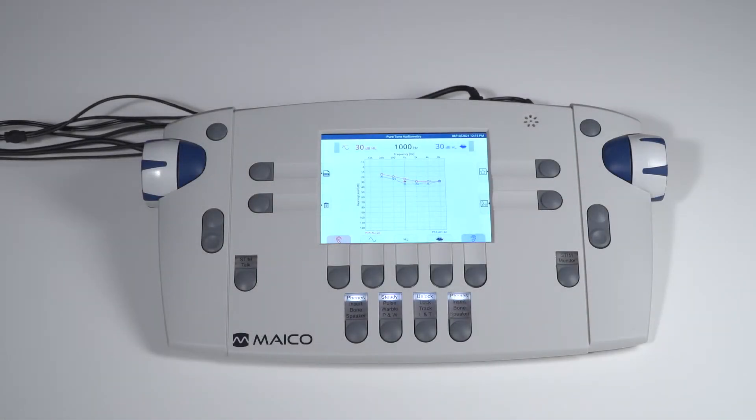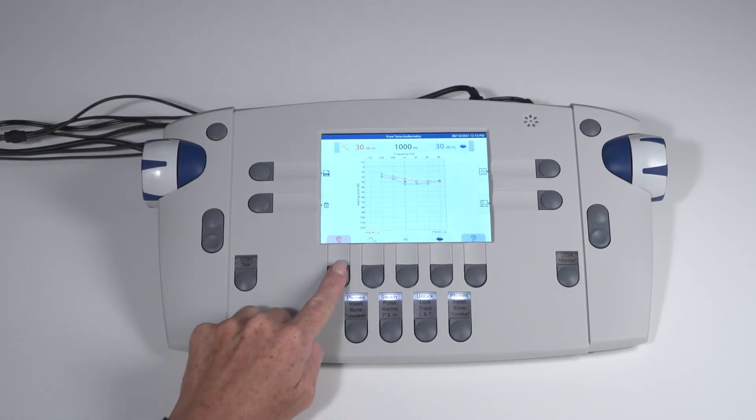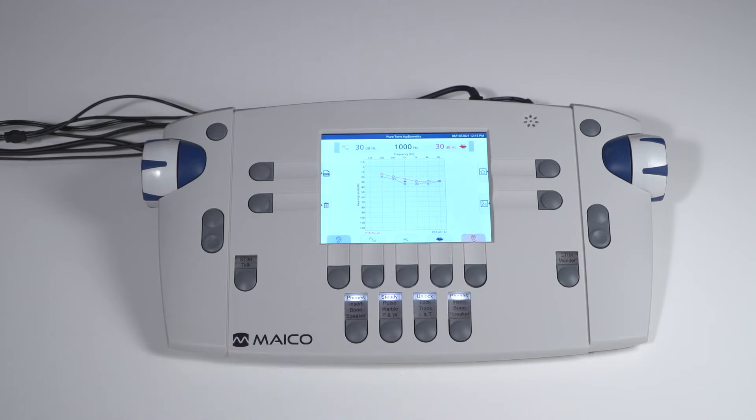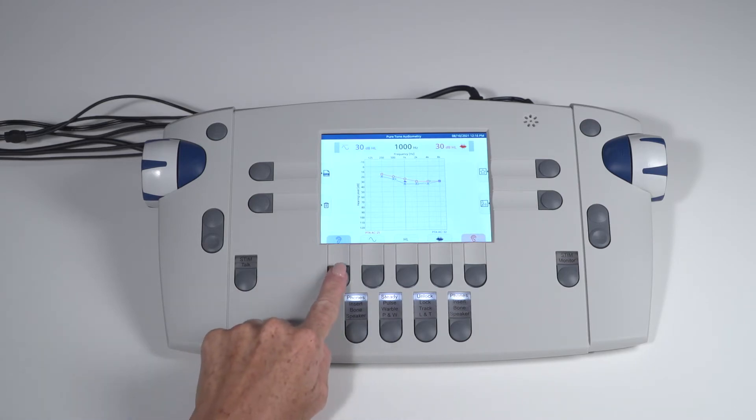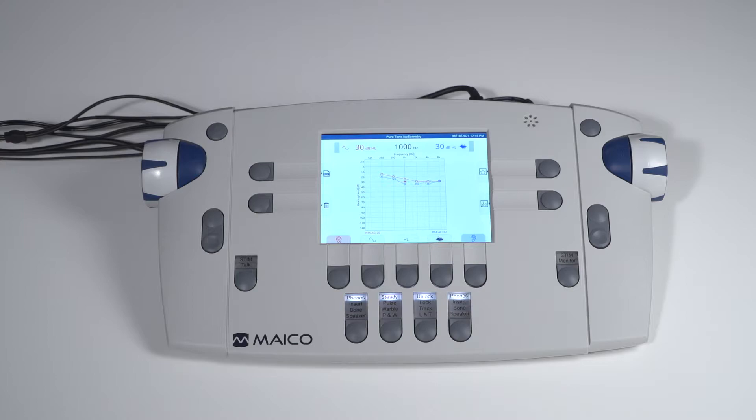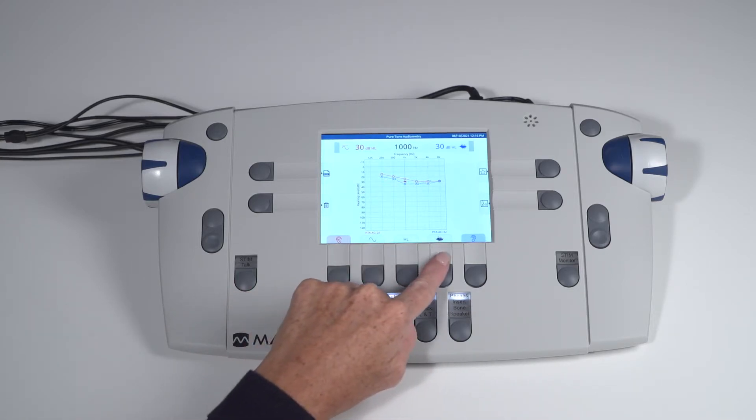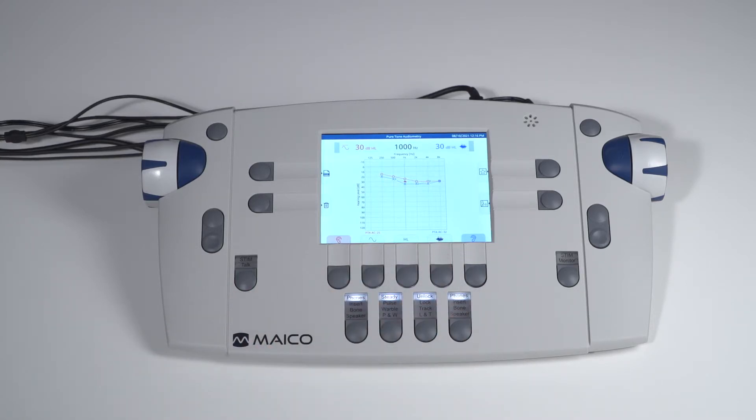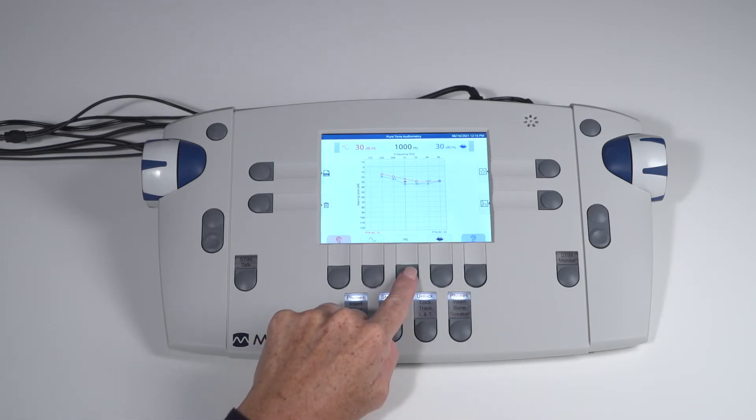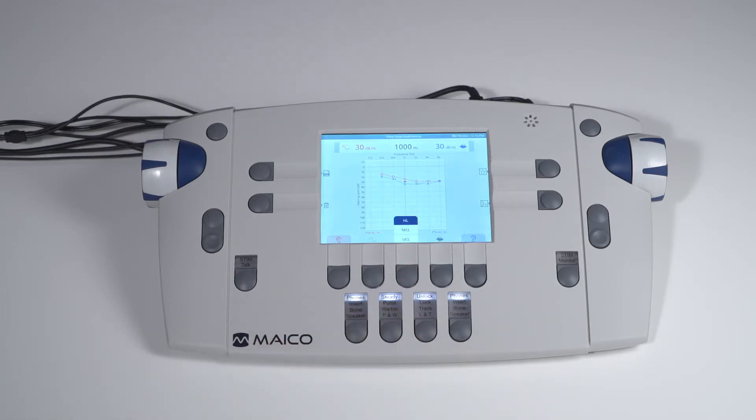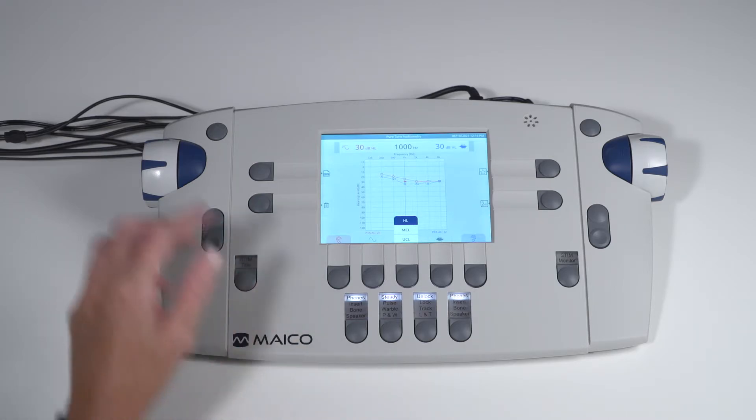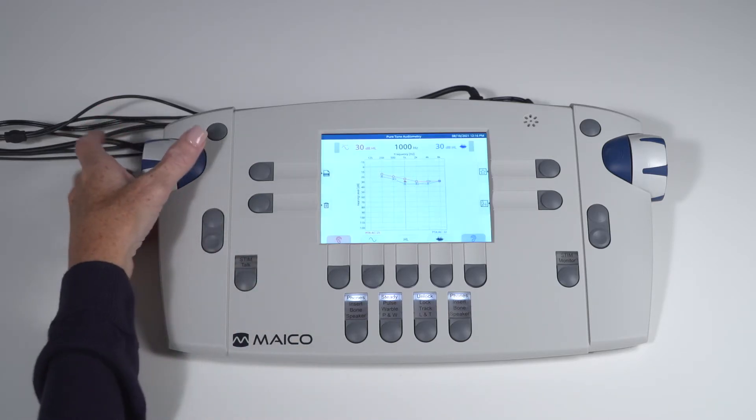The bottom keys and labels display the current status of the test selections. Change the test ear with the two outer keys, one for each channel. The signal types are with the next set of keys. Tone and masking noise are displayed here. And the center key changes test type selection for accuracy of plotting results. These options vary based on the test screen being used.